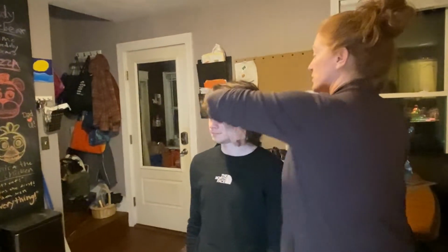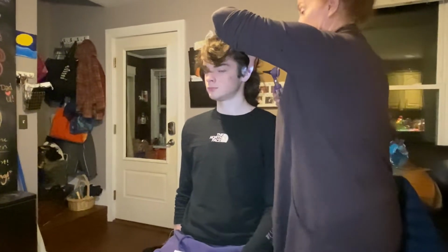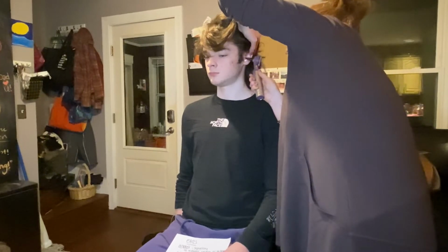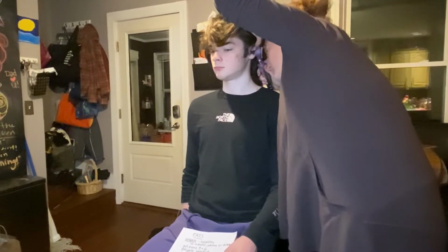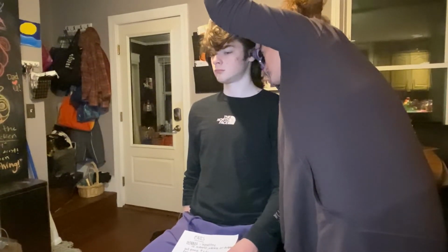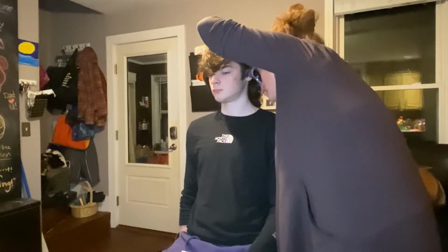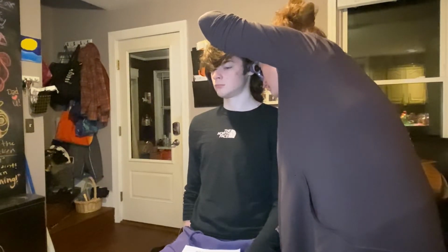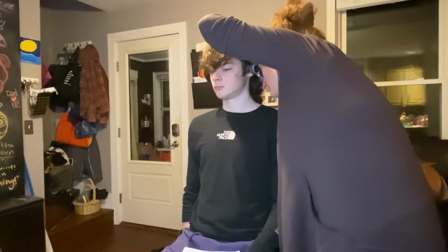All right, I'm going to do the same to this ear. I'm going to hold your ear up and back to straighten out the canal. Gently insert. And give me 1 minute. There's the tympanic membrane. This one is actually easier to visualize. Again, earwax in the canal. No redness, no edema. Malleus within normal limits.